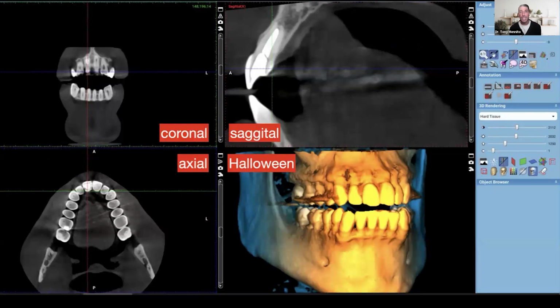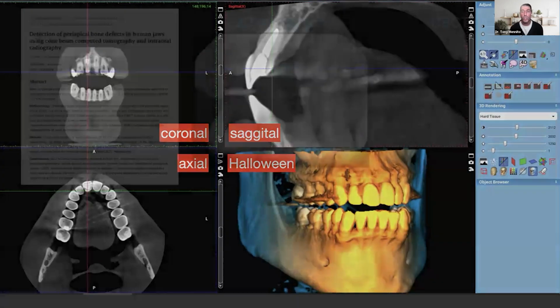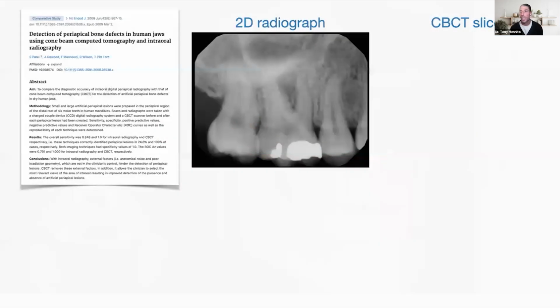These are my teeth. Speaking of taking headers, I got elbowed when I was in grade school playing basketball, and I had to get a root canal on number 8. So what you're seeing is the root canal that I got on that tooth. CBCT allows me to view that from all different angles just to make sure that everything is still in good shape. And that's not the only thing we can do, but that's really important: it gives us a lot more information to accurately diagnose, once again, whatever comes into the office.